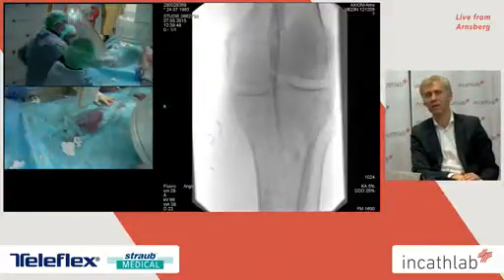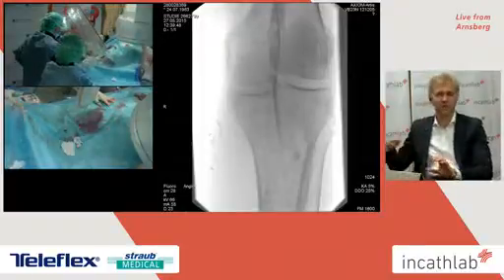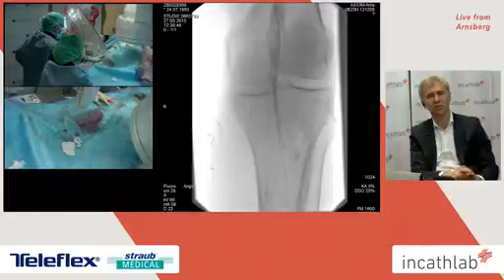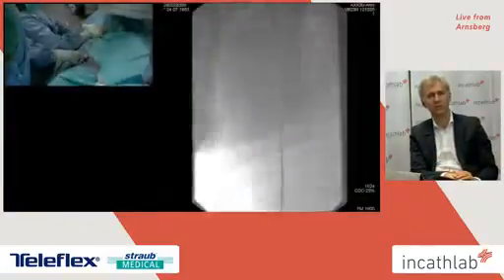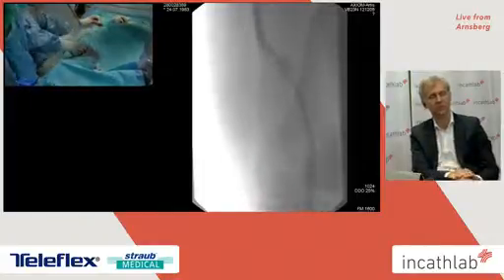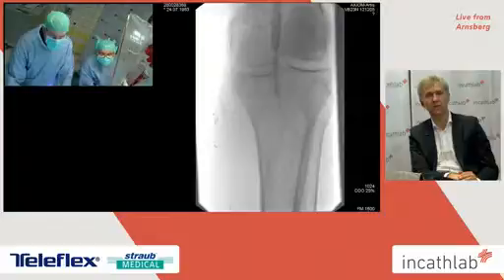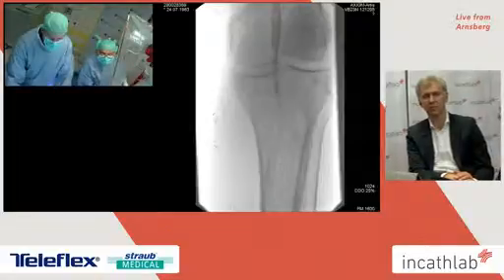Sometimes your landing zone is very short, and as you have to get a bulky system into the bypass, I would always be afraid that I may lose the sheath for the antegrade puncturing. But just to control it, it's more easy in the case. But if it is a flush occlusion, I always go contralateral. Marcus, do you agree with this approach?